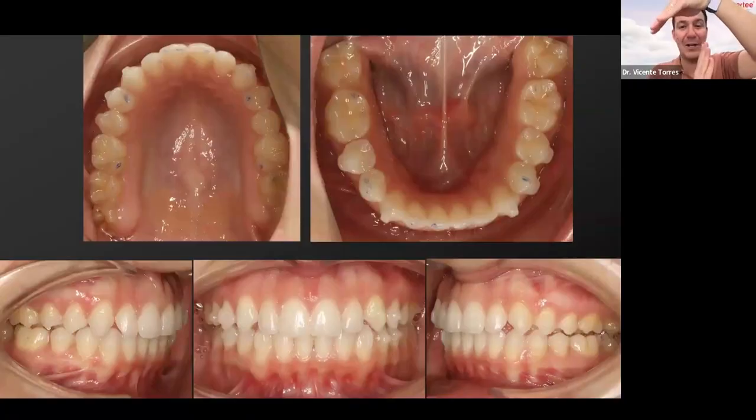The problem is we don't have overjet. We corrected the overjet a lot, and right now you can see here on the blue paper that we have contact in the anterior area. This is one of the reasons that right now the mandible is different, no? From the beginning until right now the midline was centered, and right now it's not centered. Why? Because maybe this anterior contact does not allow me to correct the malocclusion perfectly. This is not a problem because with the refinement we can correct it in a very easy way.